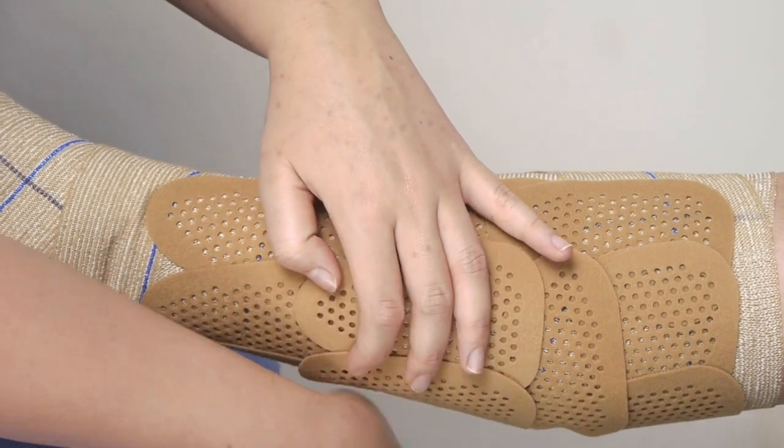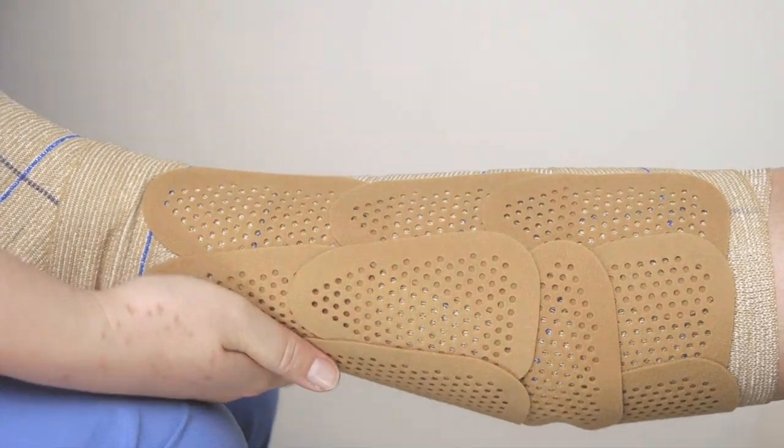Now the leg is fully covered, leaving only a gap along the line at the front of the leg.